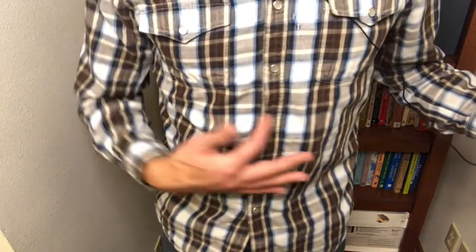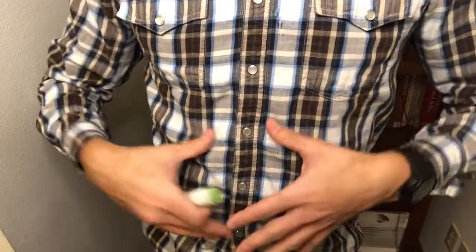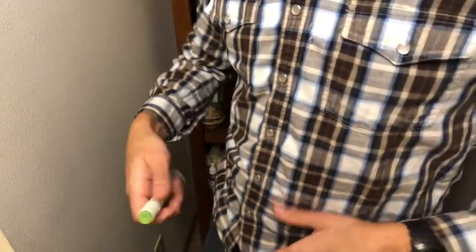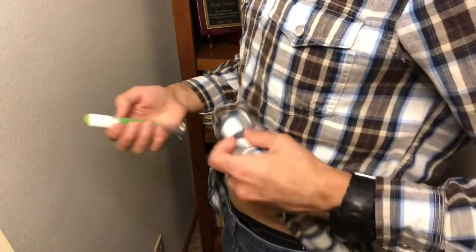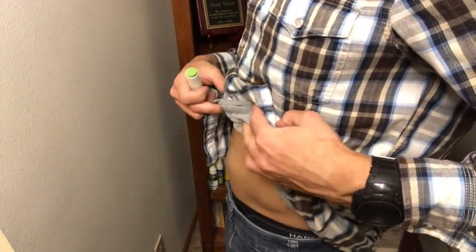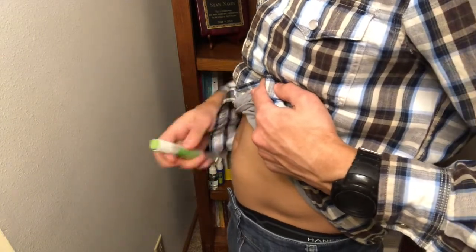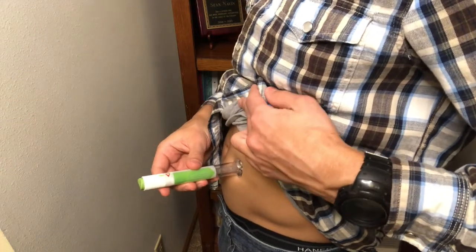But again, the most common is the abdomen, so that's what we're going to do today. Okay, so now that we've chosen the abdominal region to do the injection, now that you've taken the cap off, you can just lift up a small part of your shirt, and you just want to place it, again, here's my belly button. You're going to place it just next to it in this region.